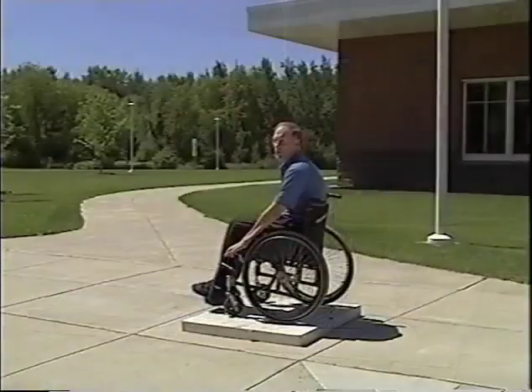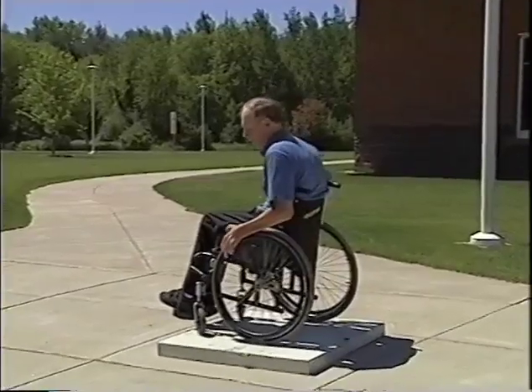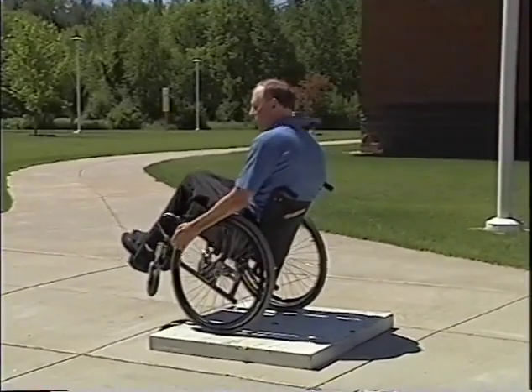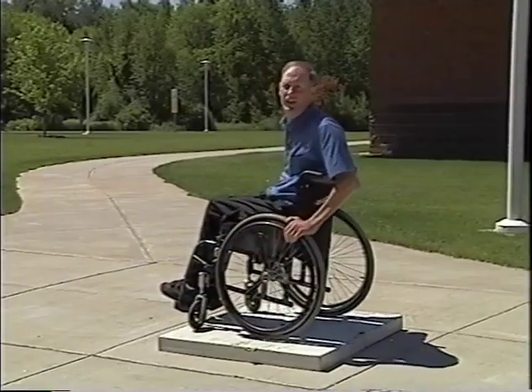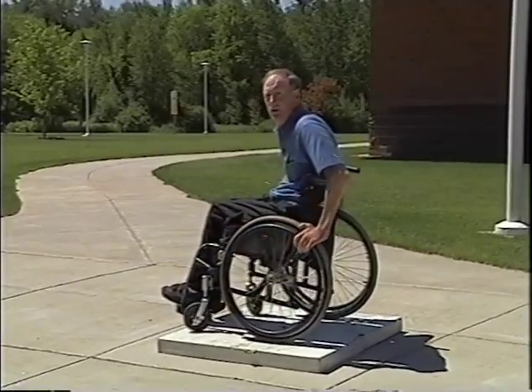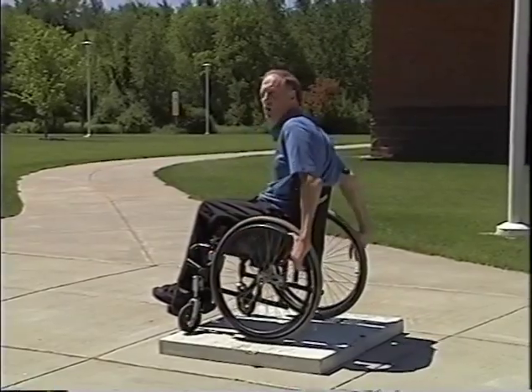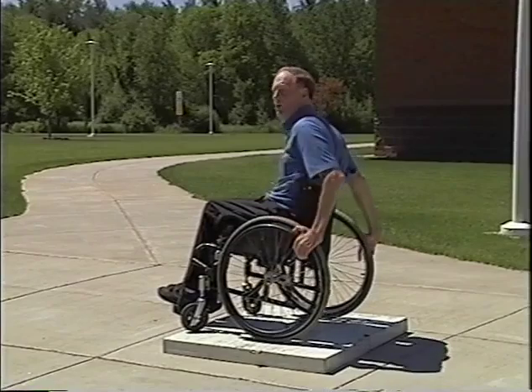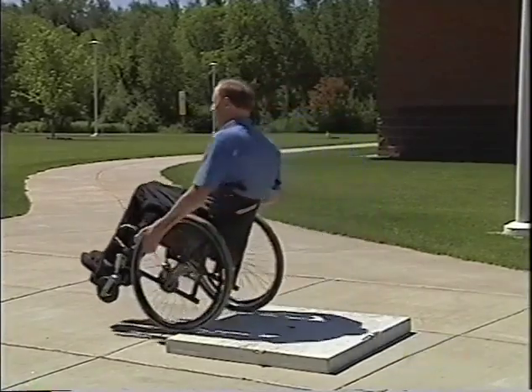Okay. One of the ways of getting off of curbs, it's called going off a curb in a wheelie. But I don't want you up here in a wheelie balancing and then going off the curb. A very dangerous thing to do. The best way to teach this is to pull a very small wheelie. You're going to feel the chair on your back, knowing that you picked it up, but then don't pick it up very high.